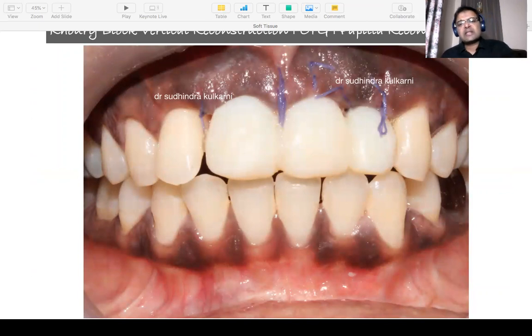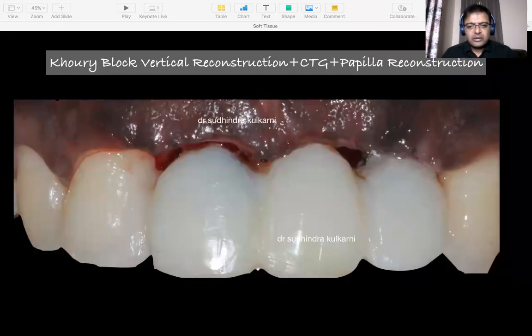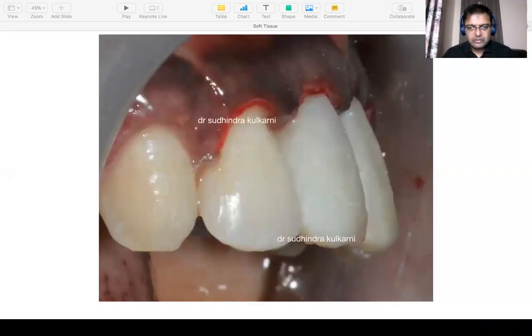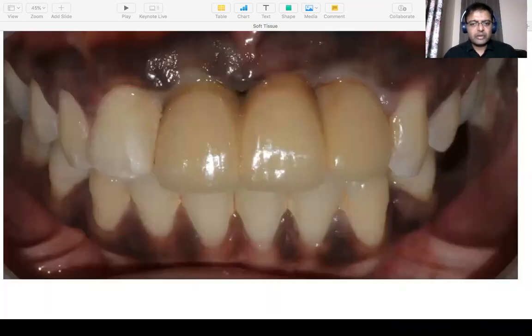You start seeing some kind of papilla between the two implants and in the pontic side. 3 months down the line, as the implants integrated, a bit of soft tissue correction, contour correction. That's how the implants look. As the soft tissue contour was done, to get a bit more accentuation, we reduced, temporized it, allowed the tissues to heal around the temporaries. So the temporaries actually help in contouring the soft tissue margin the way you want, a bit more correction.